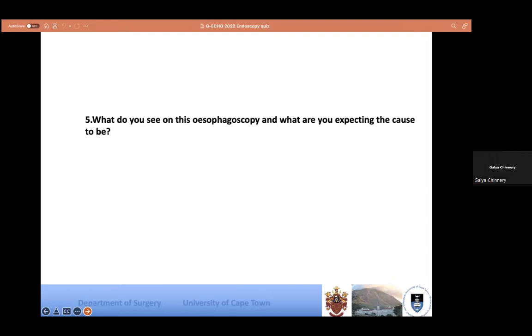Yeah, that's interesting. Again, every so often one of these things comes up, and we always attribute it to a cancer in either the esophagus or the bronchus. But perhaps you could enlighten us, if it was smaller and related to a cancer, what's the sort of cutoff size for thinking that a stent wouldn't work? Obviously, this is very high as well. So I think, yeah.